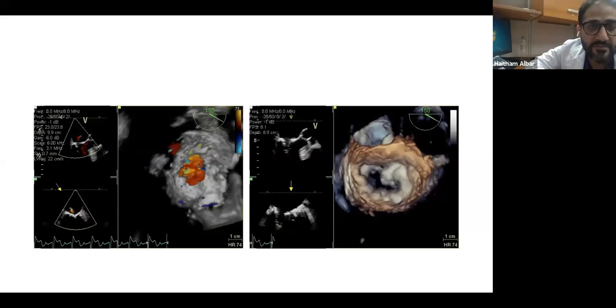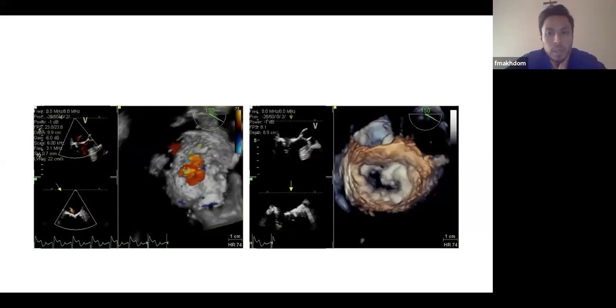Usually when you decalcify posterior mitral annular calcification from commissure to commissure, you have to apply a very large patch, commissure to commissure, from the ventricular aspect to the atrium, and then you start putting your suture. So you reconstruct the whole posterior atrioventricular junction, from commissure to commissure.